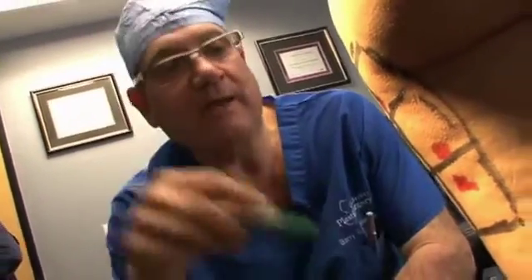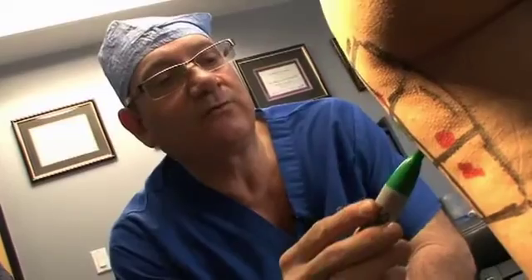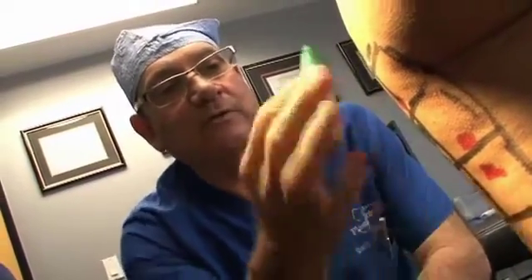These are the depressed areas, so that's going to be in red. Those are the fiber septi that are pulling down, and we're going to use the side firing fiber to saw across that, and we'll see those pop up. The other areas that are raised are the excess subdermal fat here, here, and we're going to be aiming downward with the side firing fiber to flatten those out. There's no liposuction. That's the efficiency of the 1440 alone is enough to bring these down.